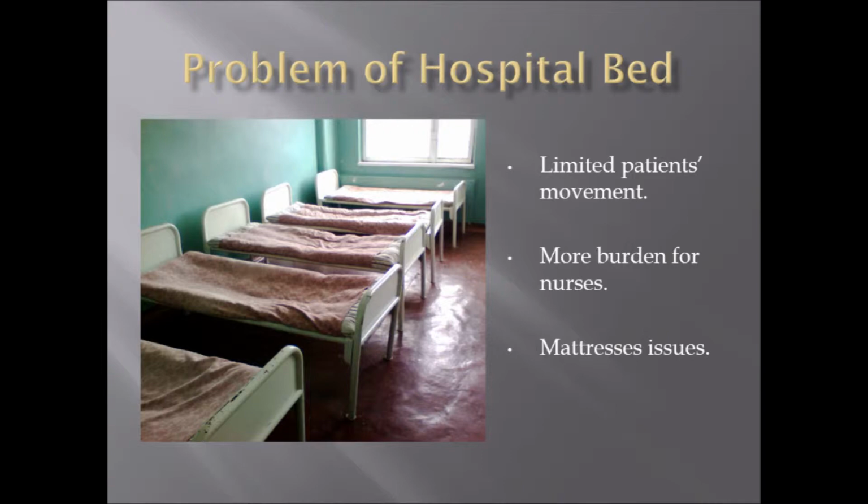The older model bed limits patient movement, as the patient tends to fall off the bed when nurses are away or busy with other matters. Sometimes the tubes even entangle patient body parts. For example, their neck got strangled by it and eventually caused death. It also causes blockage of sodium solution dripping to the patient's blood when the patient's arm tries to compress it.